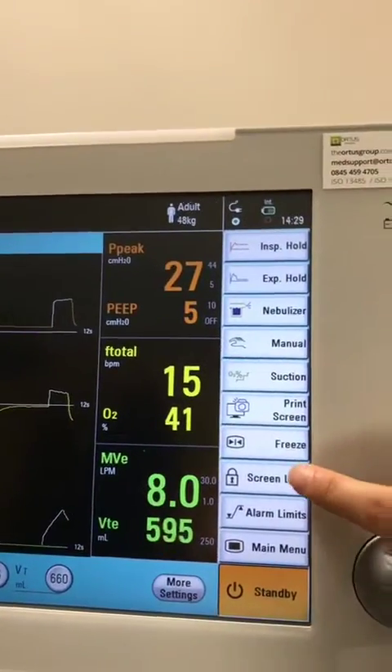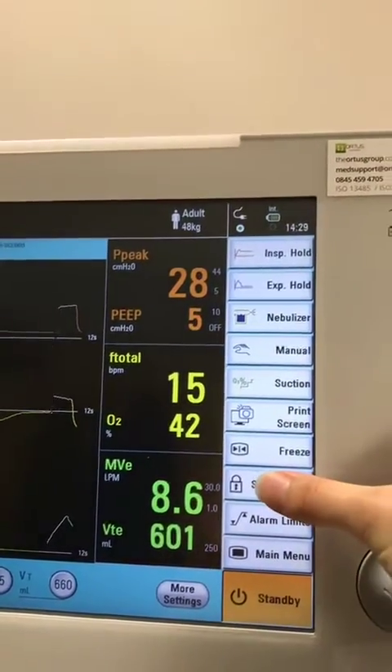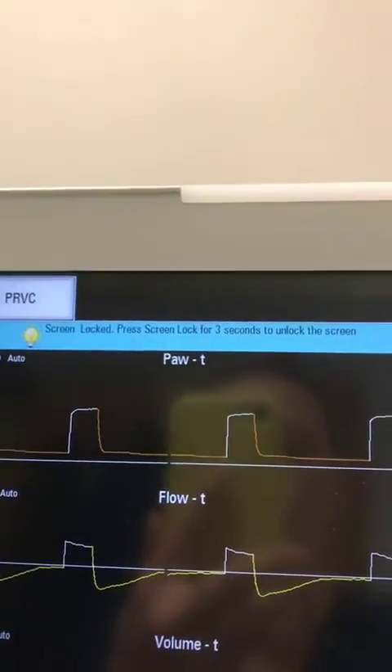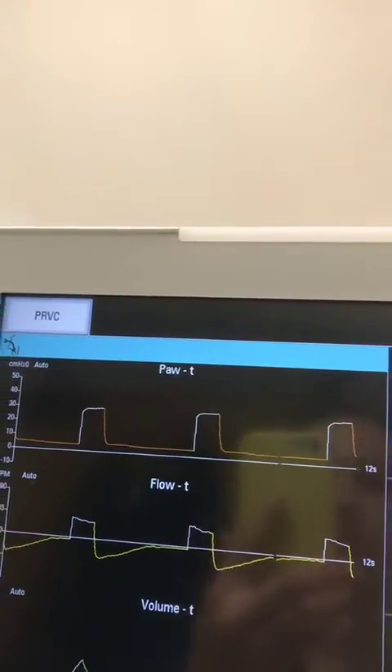You also have screen lock. If you press it once, it doesn't seem to do anything. If you press and hold for three seconds, you'll see that it turns yellow, and there's a little message up at the top. To unlock, you have to press and hold again for three seconds.